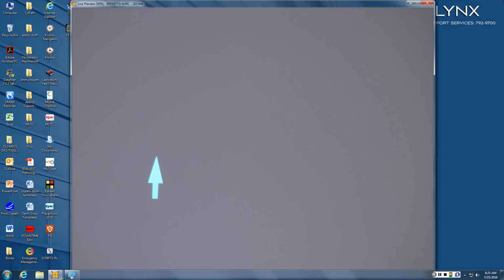So what we're doing right now in terms of lightning rounds is what you need to do on your own. There are 100 slides per box. You need to do about 500 before you own the chapter. So you just have to run through them, and no one can do it for you. You have to do it on your own.